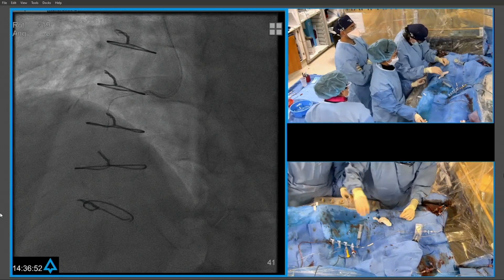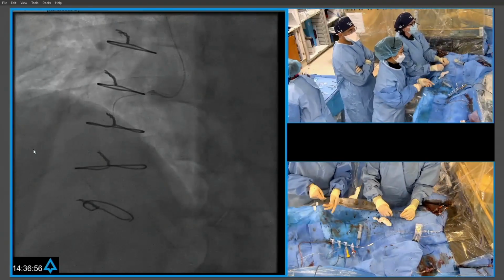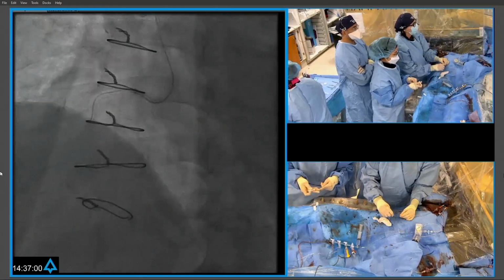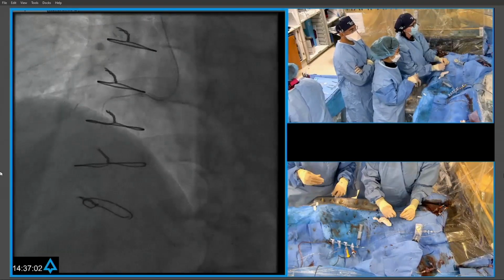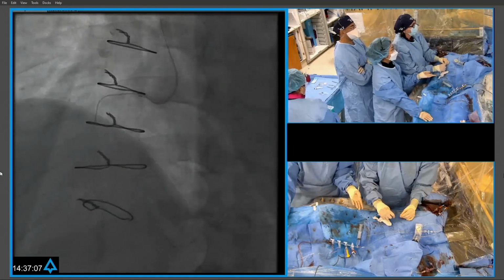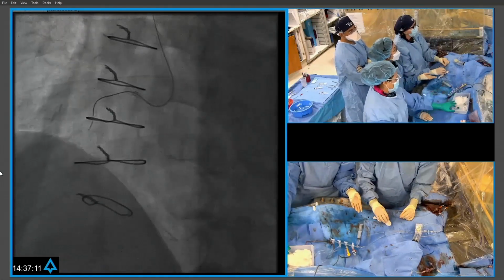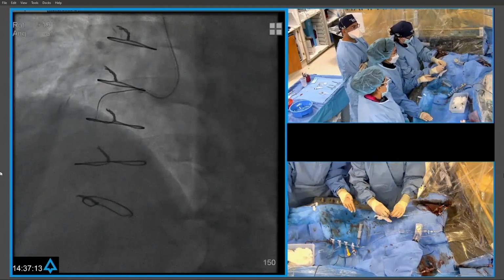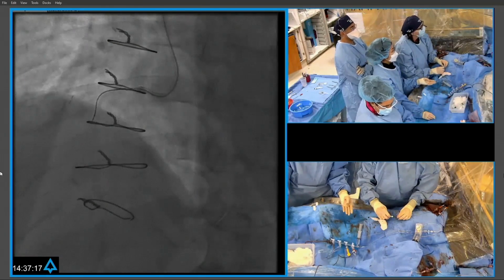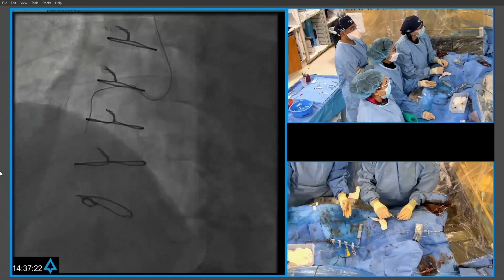Yeah. And again, the support issues of the proximal vessel are important to consider. There's diffuse disease there. If we're having issues with the microcatheter, then we'll take the microcatheter out with a trap, dilate the proximal vessel with a 3.0, then get a TrapLiner into the proximal vessel and keep working. So that's our next step. I know you may have to go to the other room. If you do that, that's probably what we're planning on doing next. Yeah, so let's just see what this second wire does, and then we'll go to the other room.